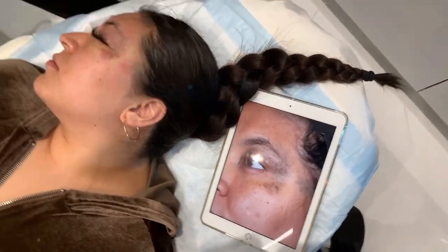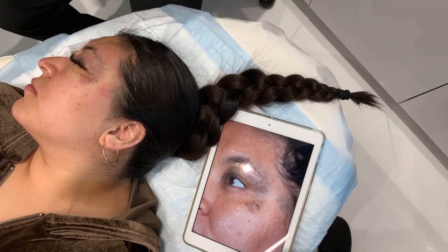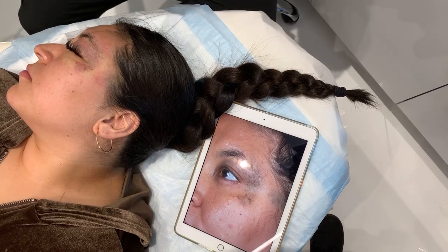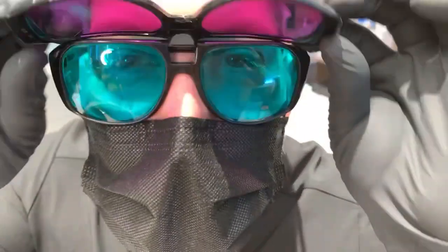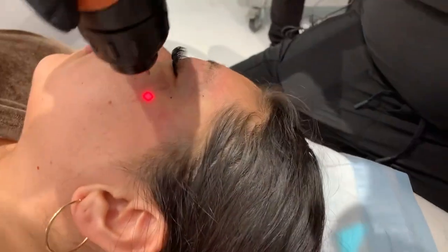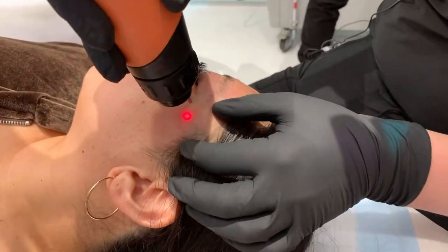The Ruby laser is a really unique laser because it goes slow, and it goes slow because, and I'm going to show you guys a couple passes, it's very superficial on the skin. And look, it has a really cool goggle. See? So we're going to do a pulse really quickly, a test pulse with the Ruby, and then I'm going to use the patch. Hold on.